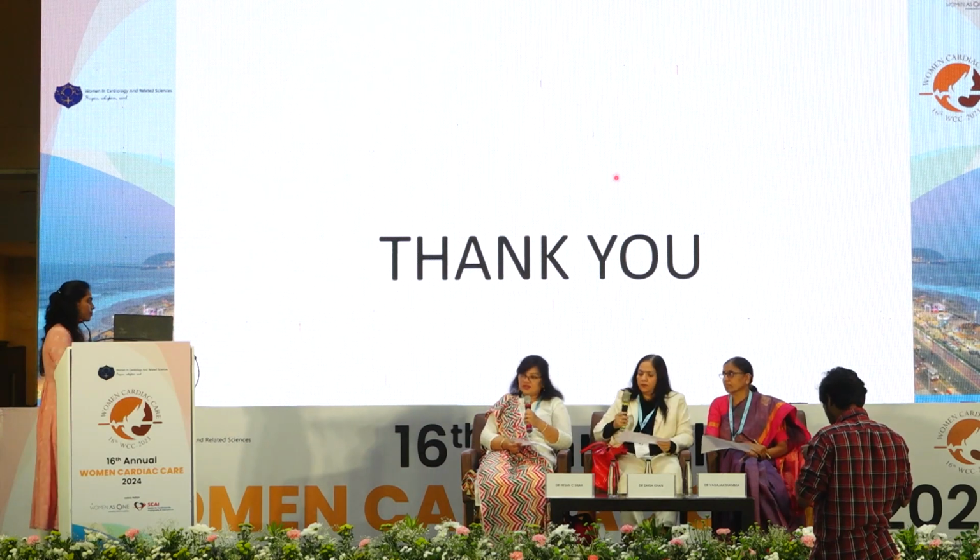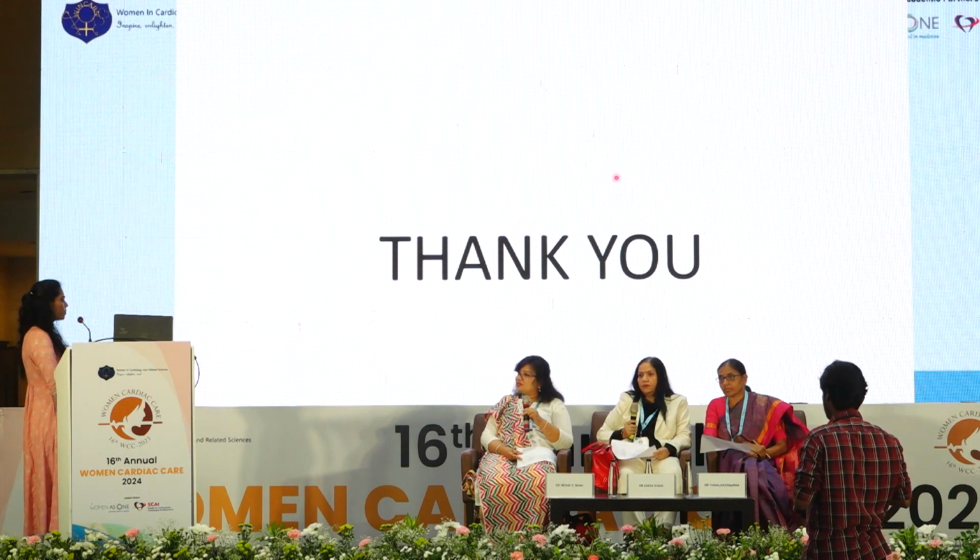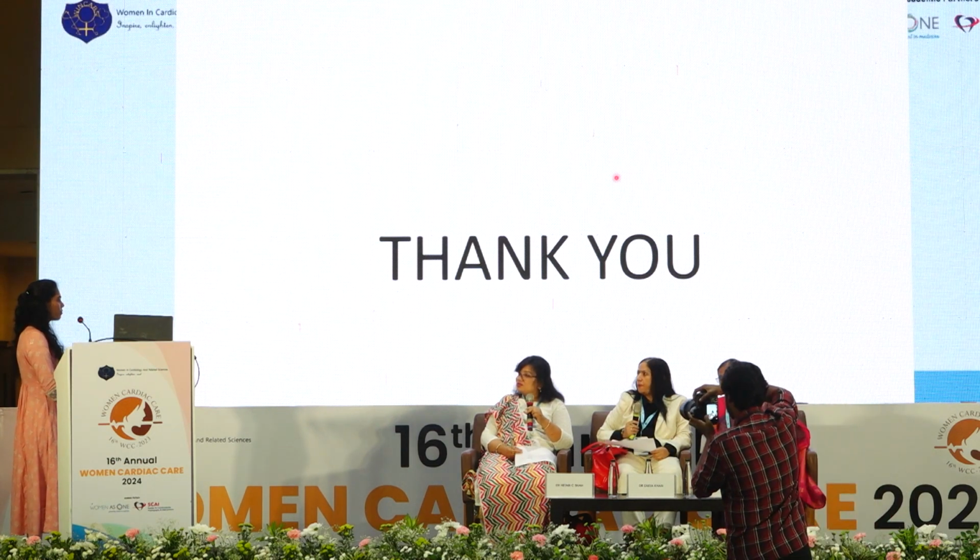Really a very good case. But why not upfront imaging rather than CT-CAG and FFR? Because the lesion was quite significant. So why was an upfront two-stent strategy not planned? And regarding the circumflex origin, with plain balloon angioplasty, what is the role of DCB in such cases?